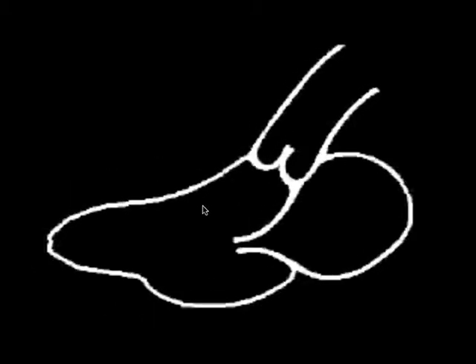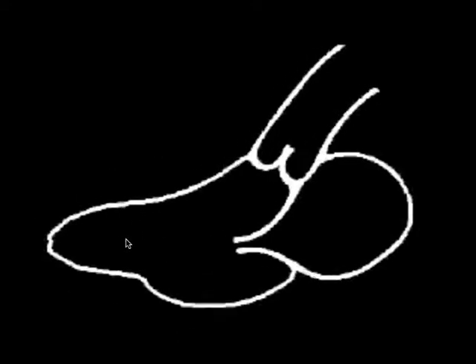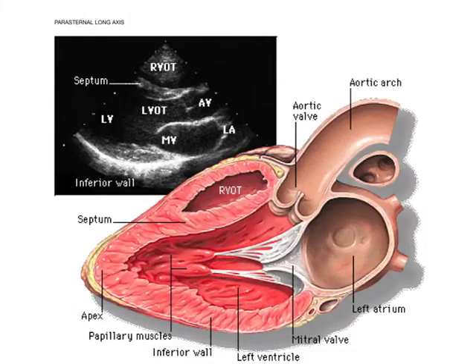And what's happening is this anterior leaflet of the mitral valve comes up and smacks into the septum of the heart, and also the interventricular septum and the posterior wall, they come together towards an imaginary red blood cell sitting right here in the middle of the left ventricle in normal patients. So we should see that nice movement of the anterior septal leaflet of the mitral valve, and we should also see good movement of the interventricular septum and the posterior wall as they come towards each other.